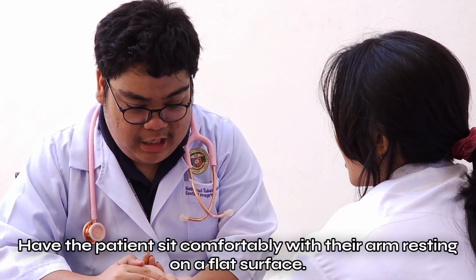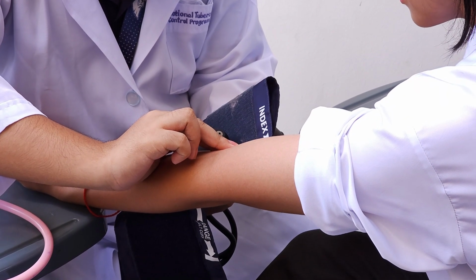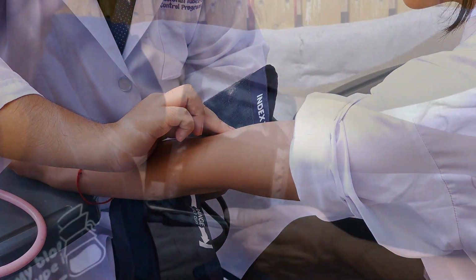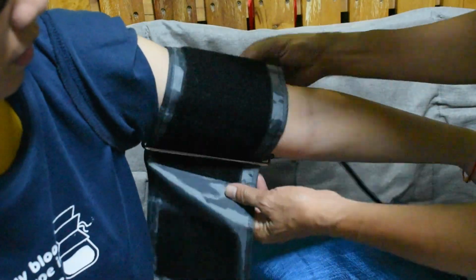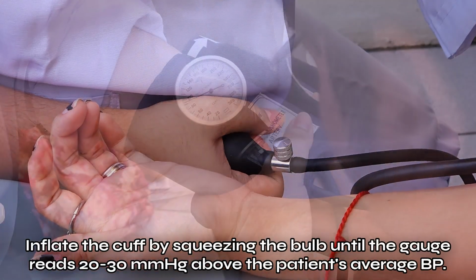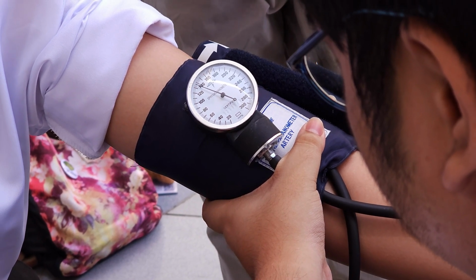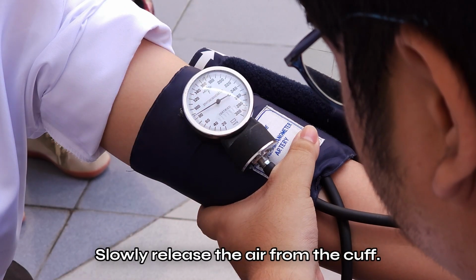To get the blood pressure, have the patient sit comfortably with their arm resting on a flat surface at heart level. Ensure that they are relaxed and have not consumed caffeine or smoked within 30 minutes. Place the blood pressure cuff around the upper arm about 2 to 3 centimeters above the elbow. Inflate the cuff by squeezing the bulb until the gauge reads about 20 to 30 millimeters of mercury above the student's normal systolic pressure based on their history or estimated blood pressure.